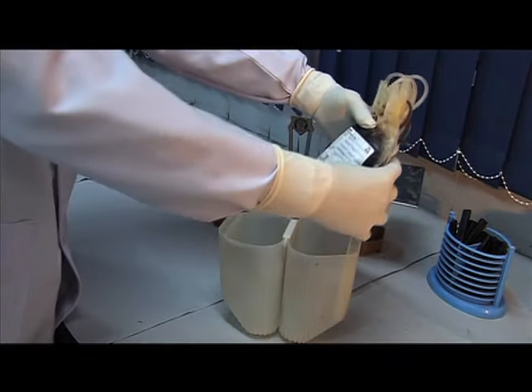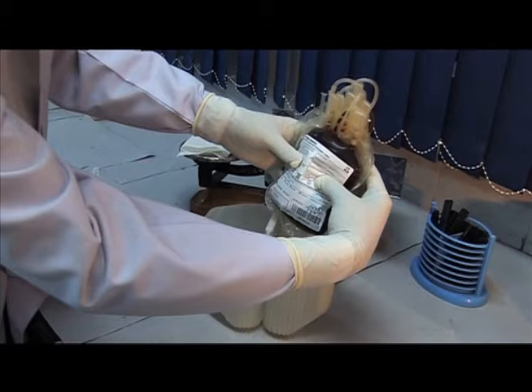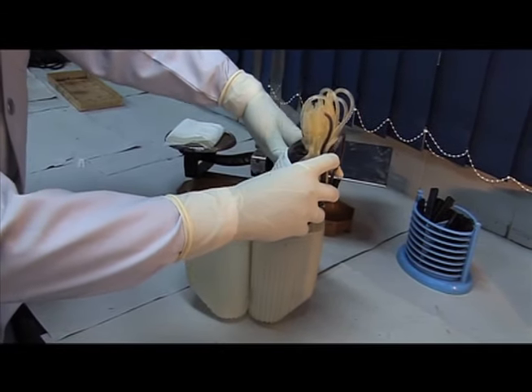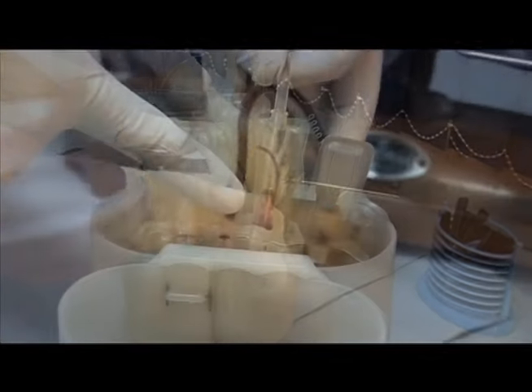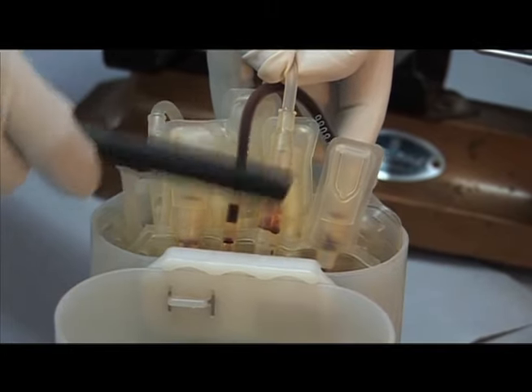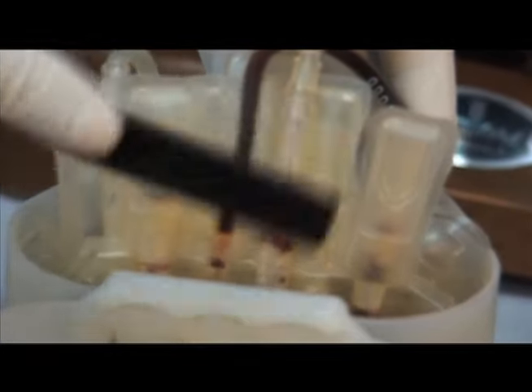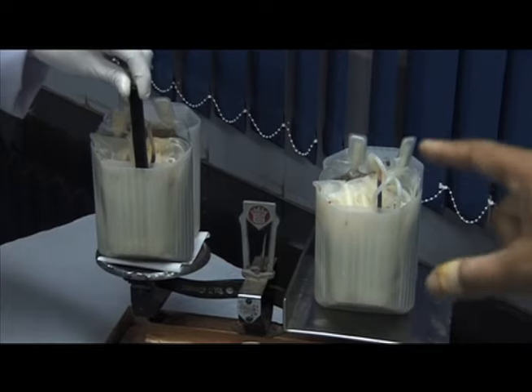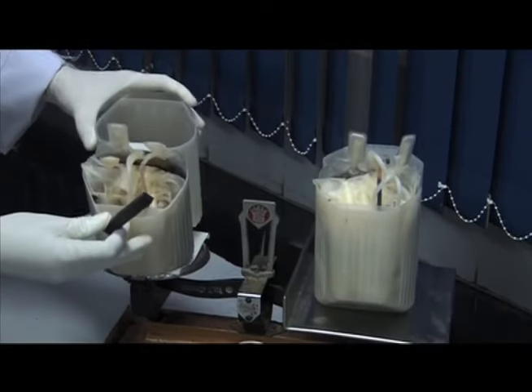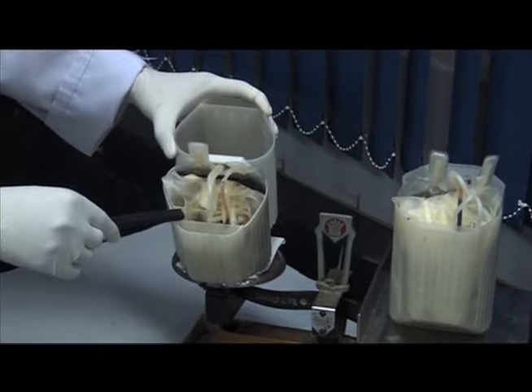The primary bag is always kept towards the inner side, and all the tubings except those of the primary bags are folded and placed towards the inside to avoid entangling during centrifugation. Some of the red cells are collected near the cannula. These are tapped down so that they do not contaminate the plasma component. The blood bags are now balanced with the help of the balancing sticks. These balancing sticks are placed in the sockets which are provided on the outer side of the bucket and not along with the blood bag.